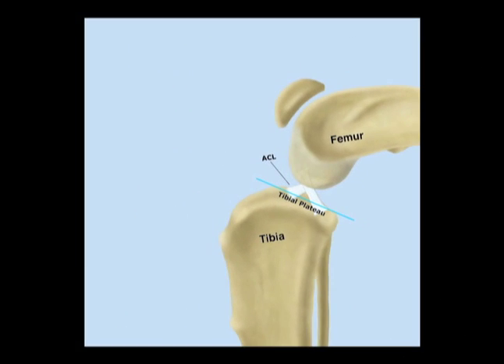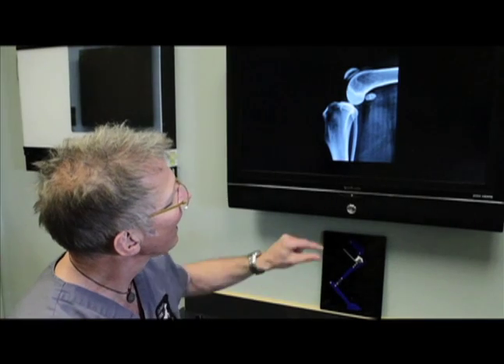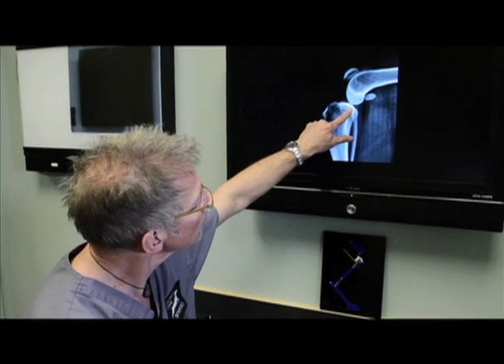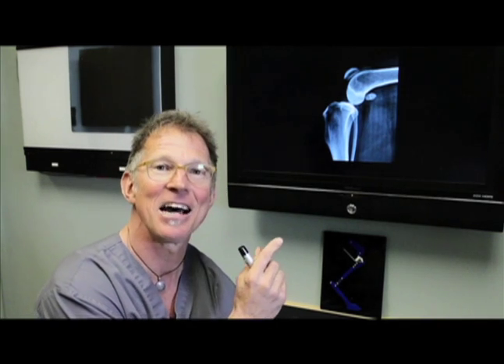And here we see the same orientation, a radiographic image, and again, femur above the joint, tibia below the joint, and the downward, backward sloping tibial plateau, different than a human. And so that anatomic point is key.